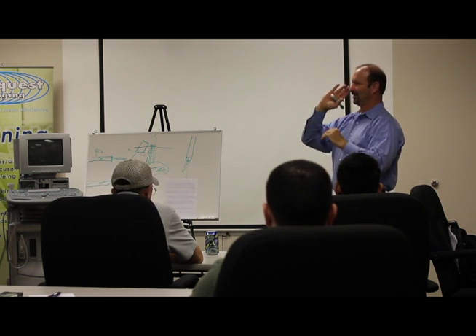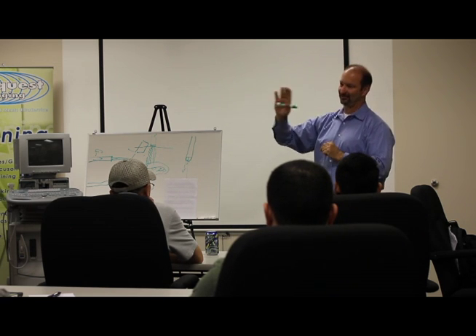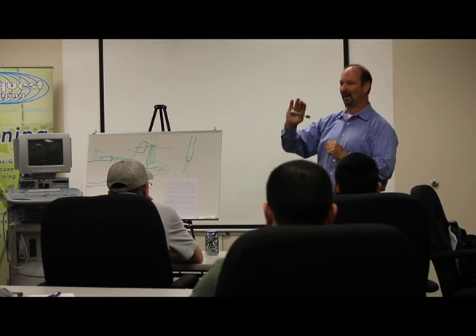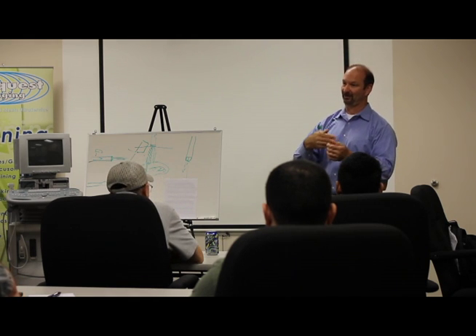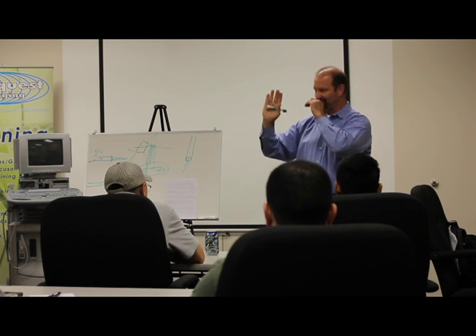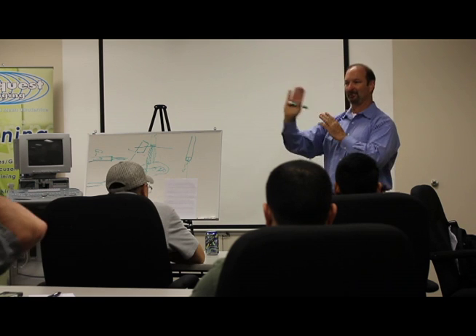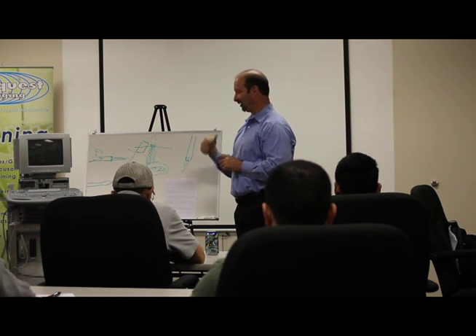And there's an equation for, I send a frequency out to you. I know it takes a second to get there. And if it gets back in 0.98 seconds, that means you're coming at me. It hits you and it's coming back faster. If it takes longer than a second to get back to me, that means that it hit you, but the second one took a little longer to come back. That means you're moving away. So that's exactly what we do in ultrasound when we're looking at carotid arteries.